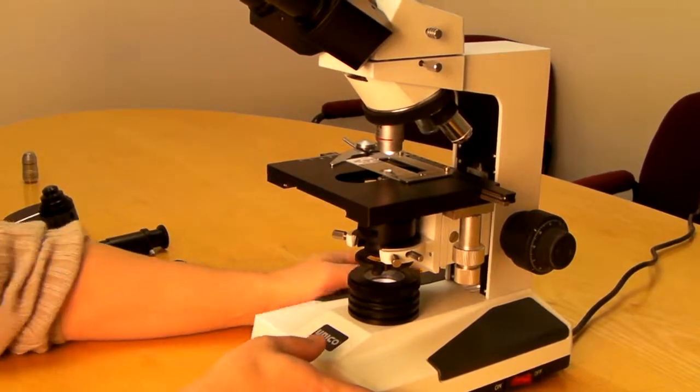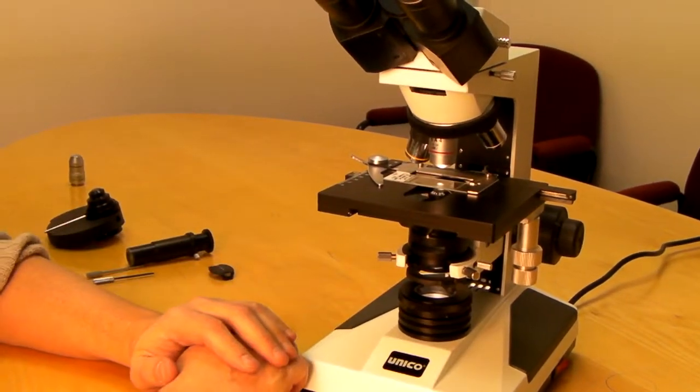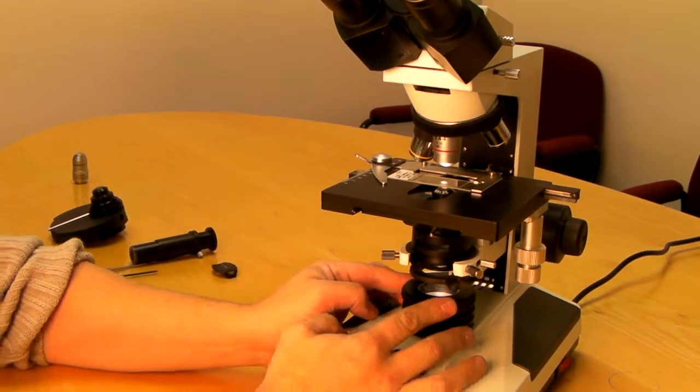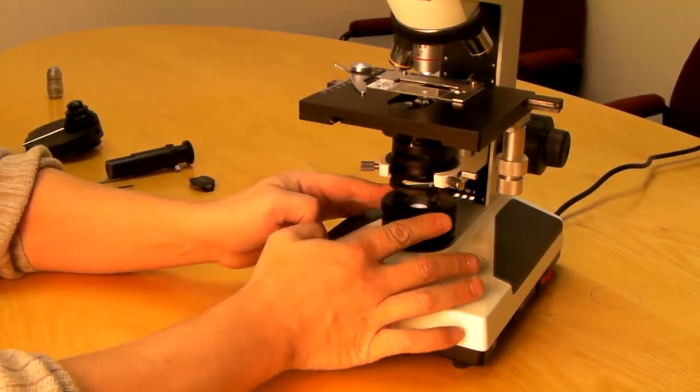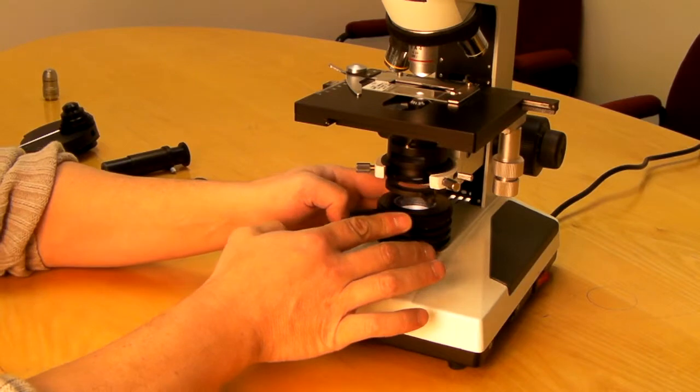Before we begin, I'd like to point out a few parts that we will be using when installing the phase set. First is a field diaphragm. This will open and close the diaphragm on this lens housing.